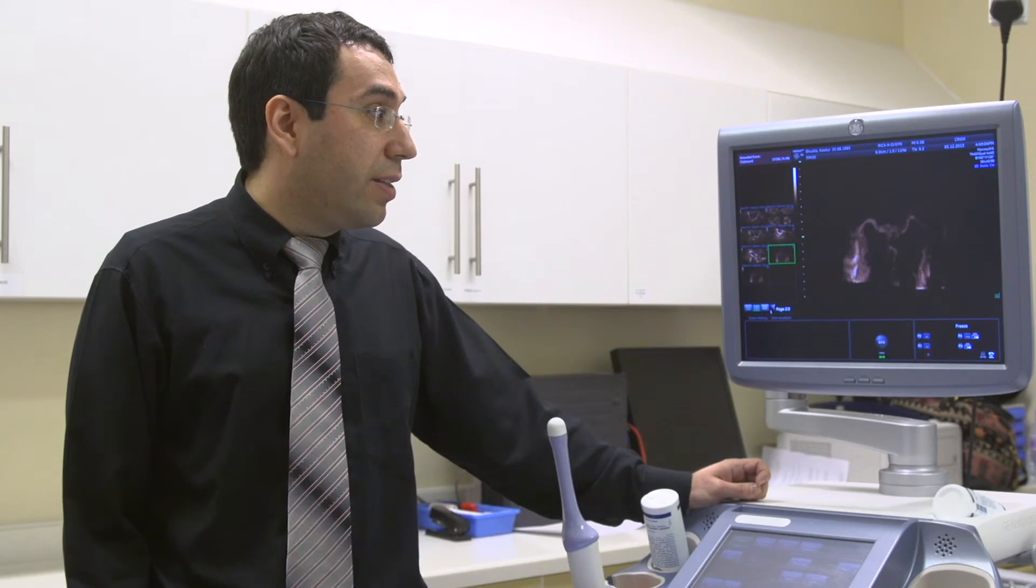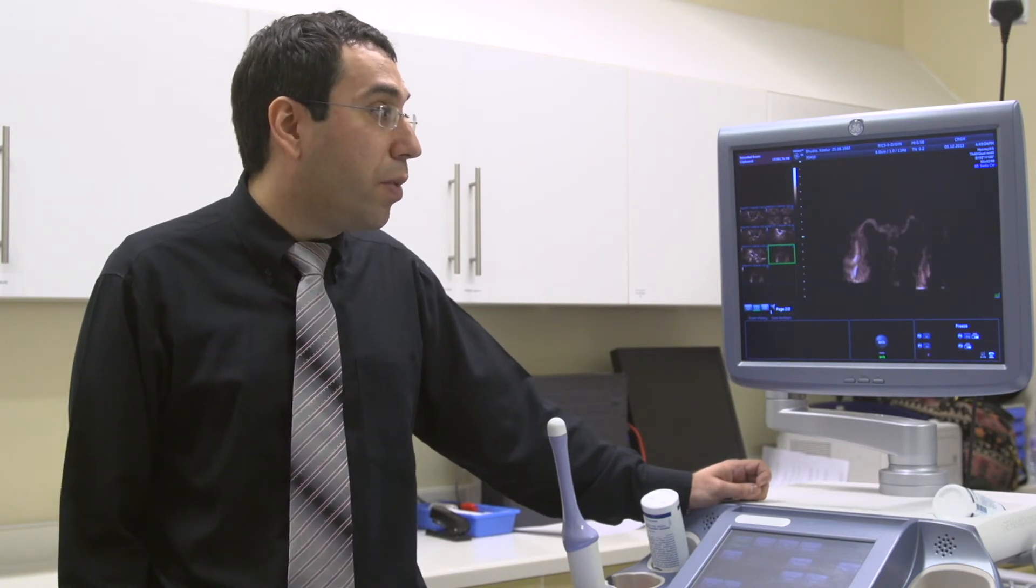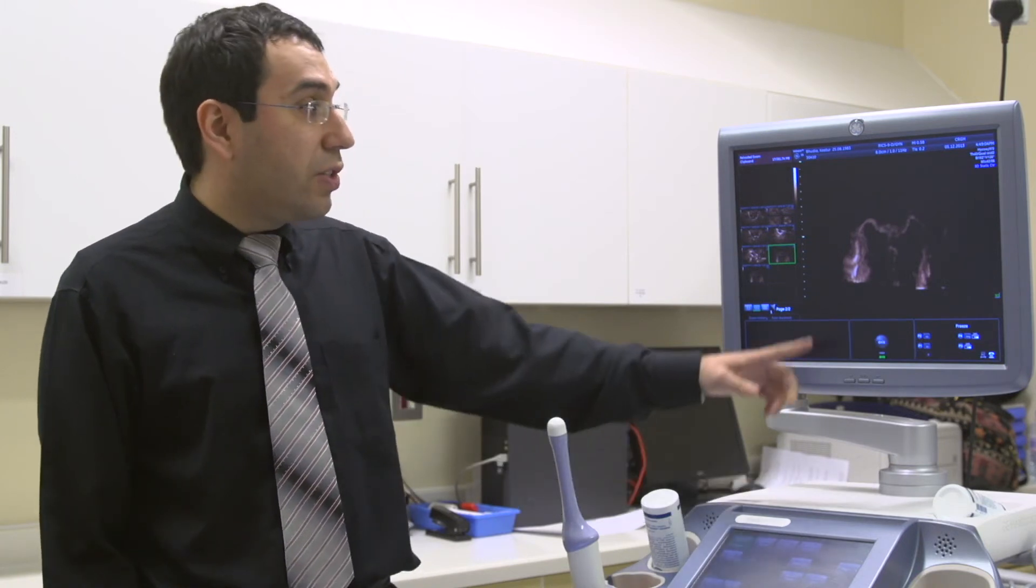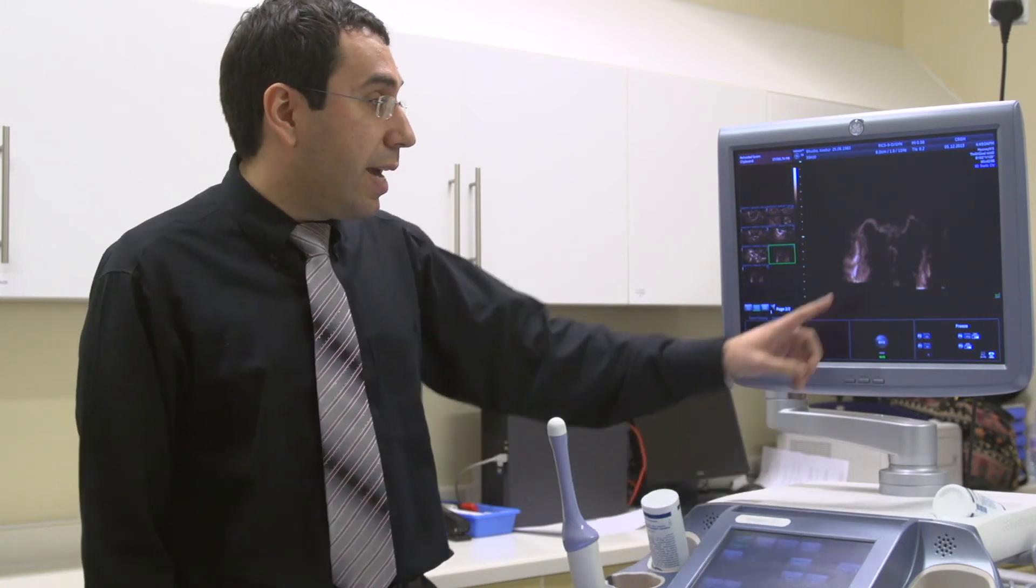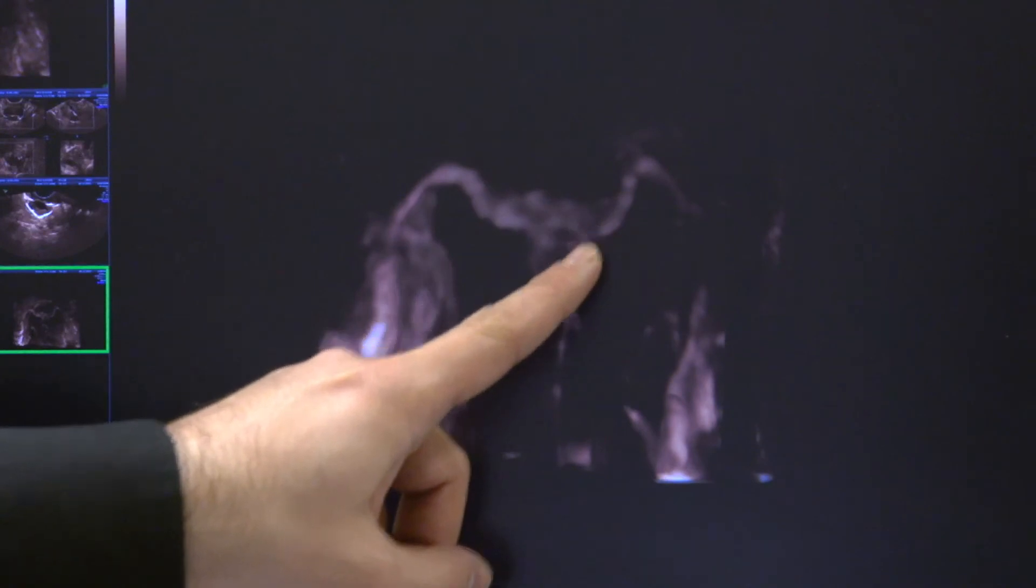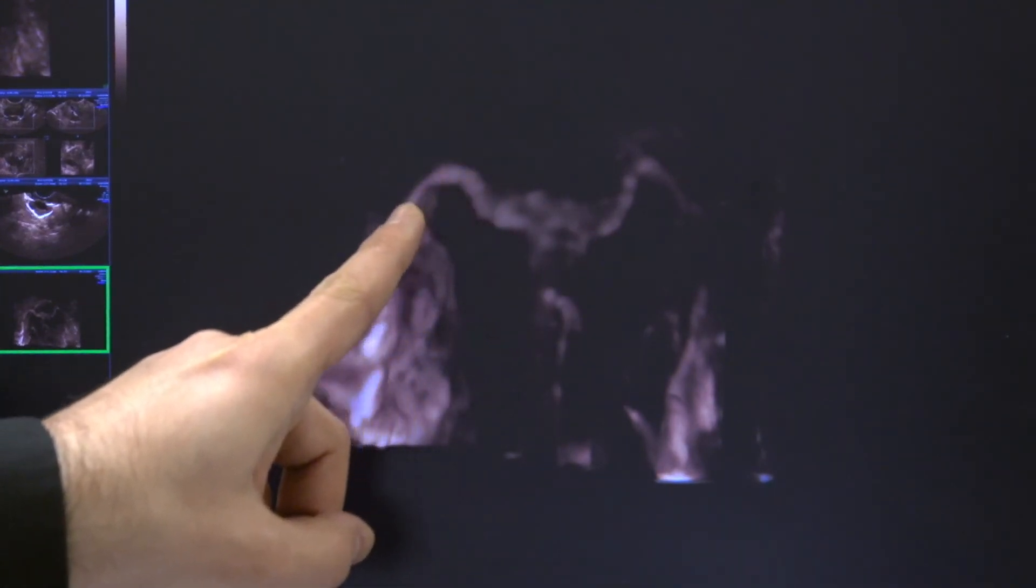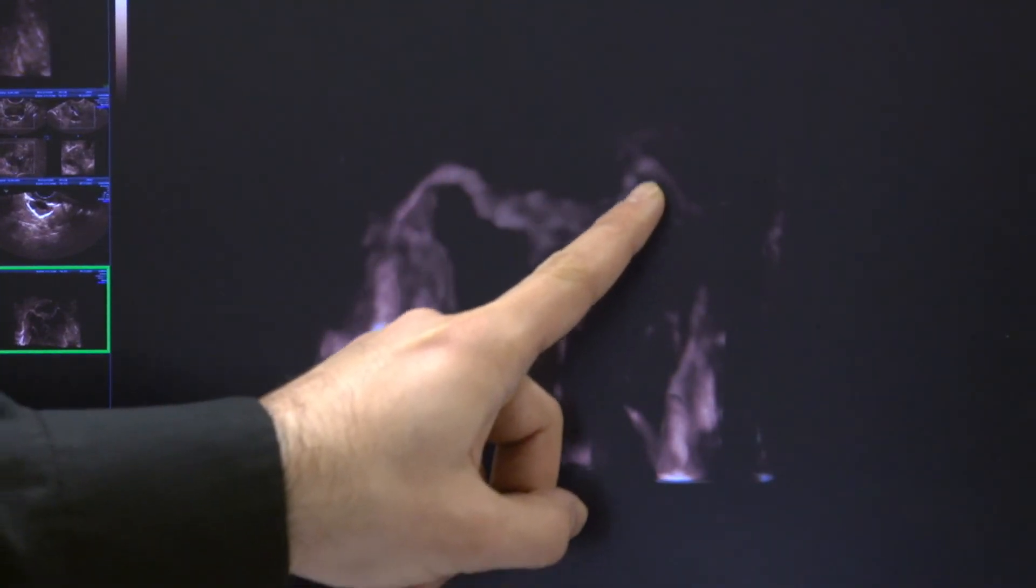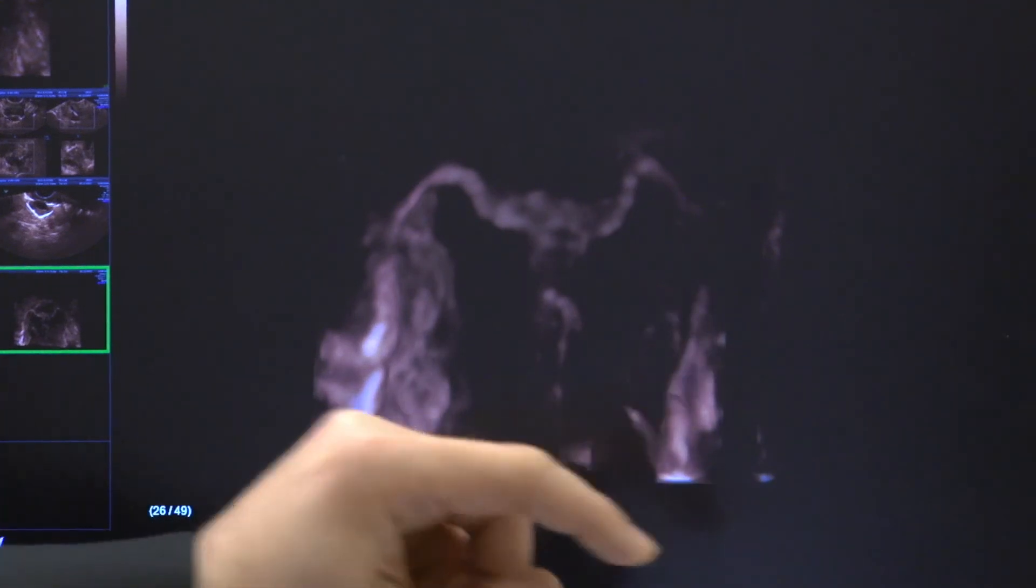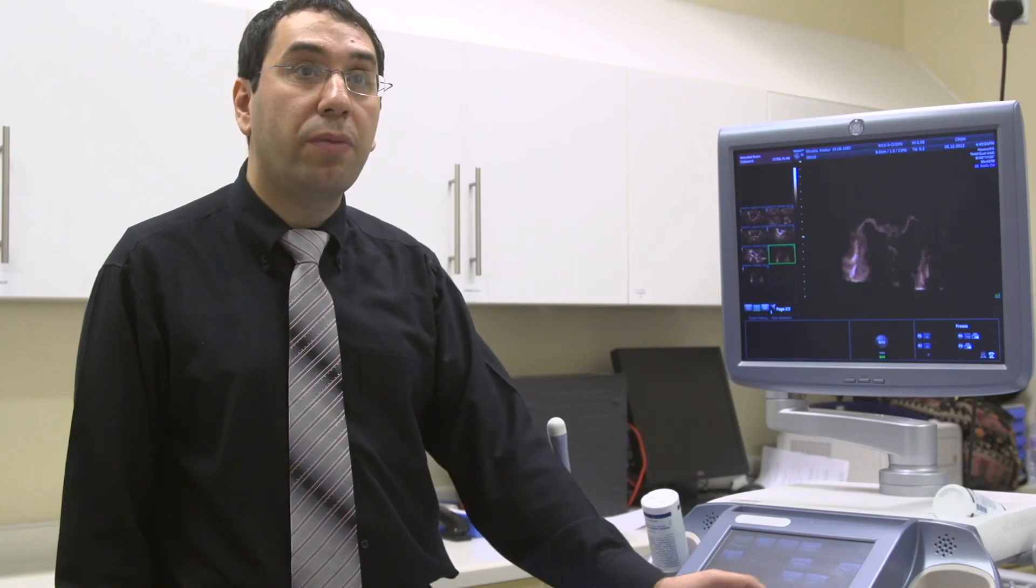As you can see on the screen, this is an example of a normal 3D hysterocontrast sonography or 3D HyCoSy. The bright stuff is the dye and you can see that's the uterus and this is one tube and the second tube. In three dimensions, you can rotate the tube around different axes to make sure that the tube is normal from top to bottom.